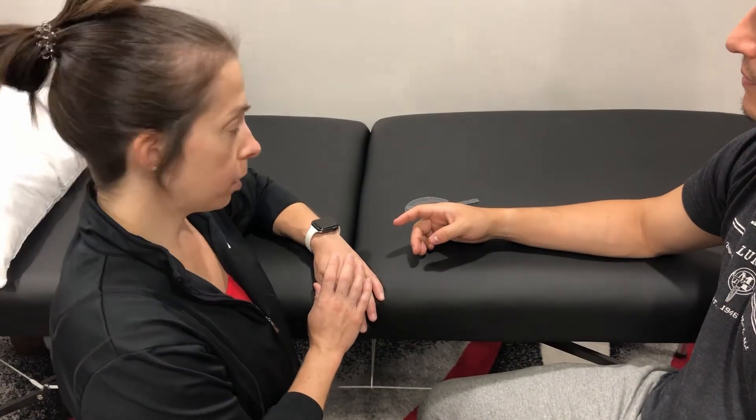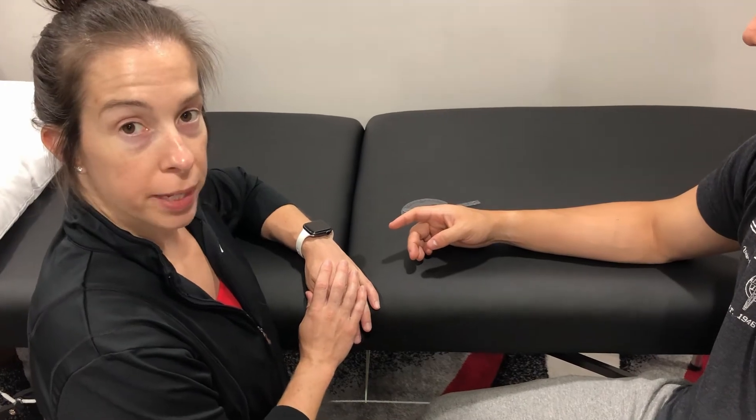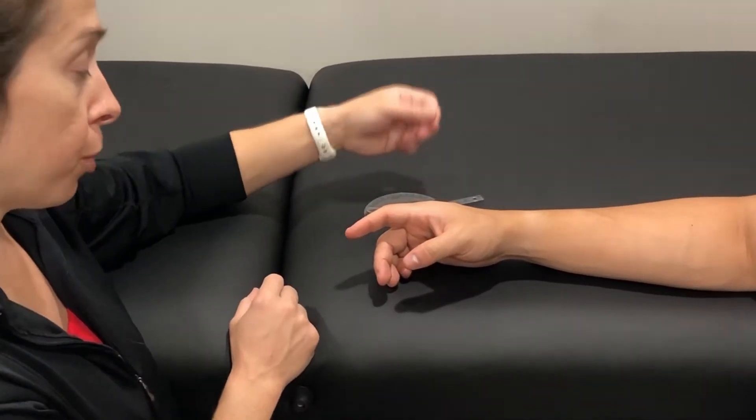Measuring flexion of the DIP joint. Patient is seated. Arm and hand are supported on the table. Checking passive range of motion first.